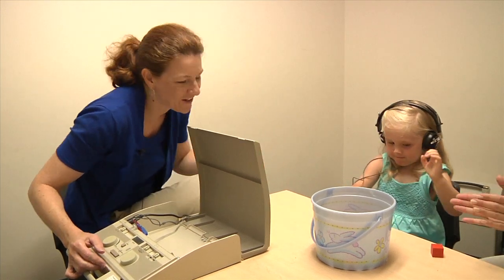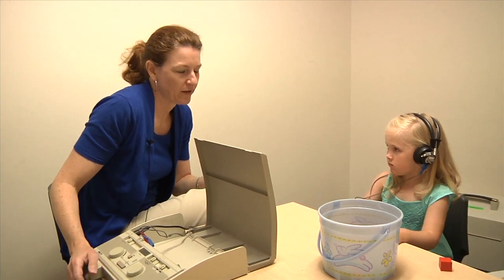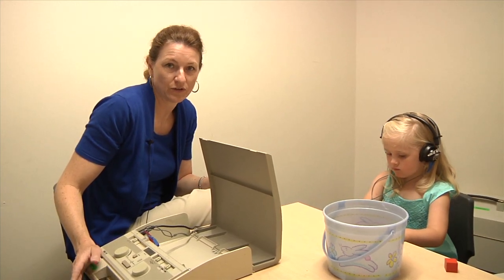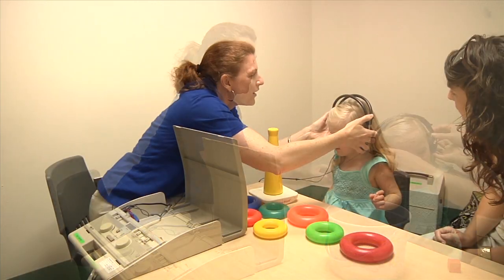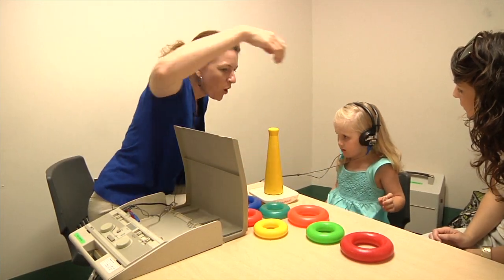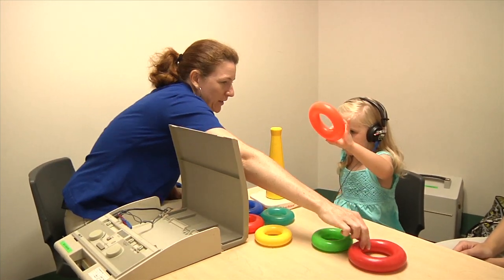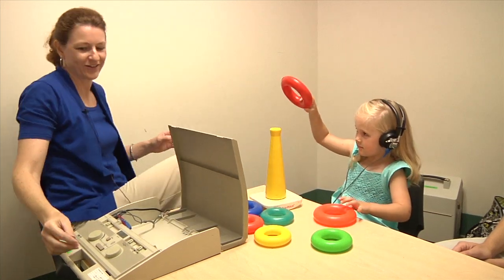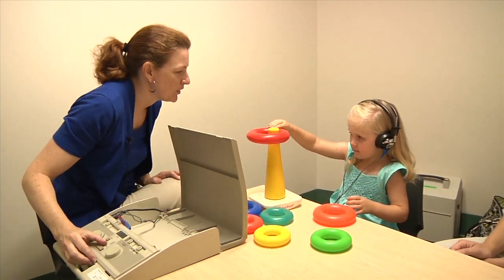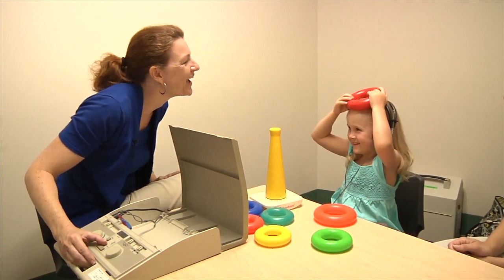Yay, good job. Okay. All right, and there are other kinds of activities, whatever toys that you have at hand, you can use. So let's try a couple more. All right. Okay. Which is the biggest ring? Which is the biggest one? Oh, is that the biggest one? Or is that the biggest one? Oh, okay. You ready? Oh, we got to listen. Listen, listen. Ready? You're silly.